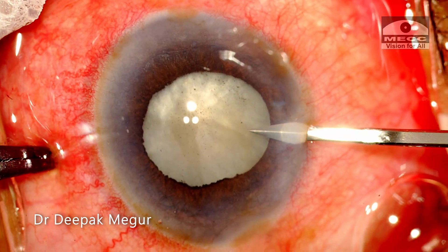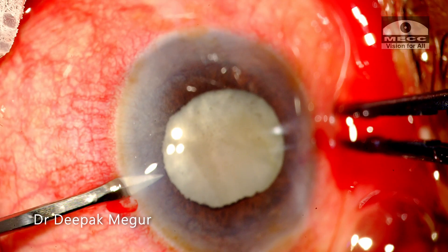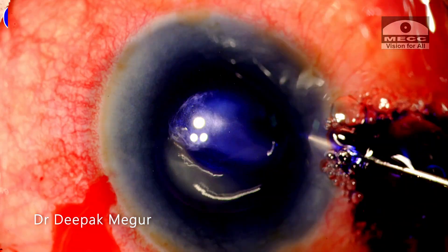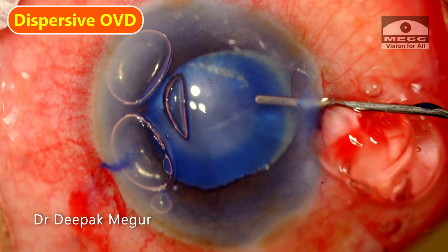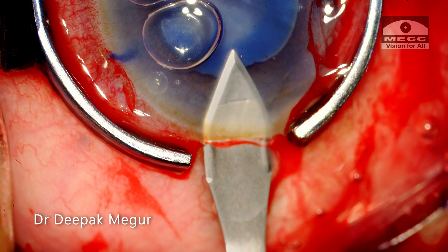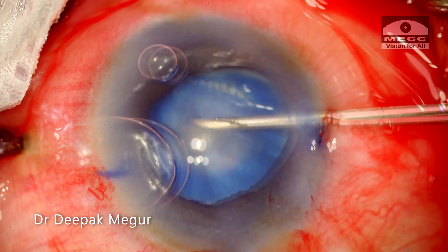Two paracentesis incisions are created. While doing the side port incision, the blade touches the iris, just demonstrating the extreme shallowness of the anterior chamber. The capsule is stained with trypan blue. Dispersive OVD is used to coat the endothelium and also deepen the chamber. The main 2.8 mm incision is created. The capsule is punctured with a bent needle.